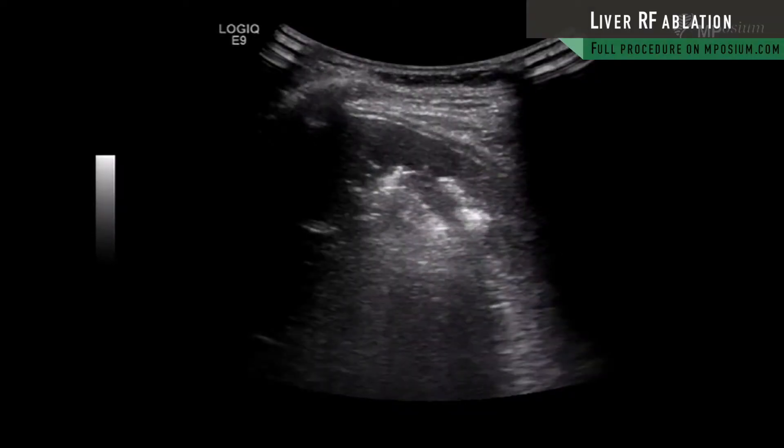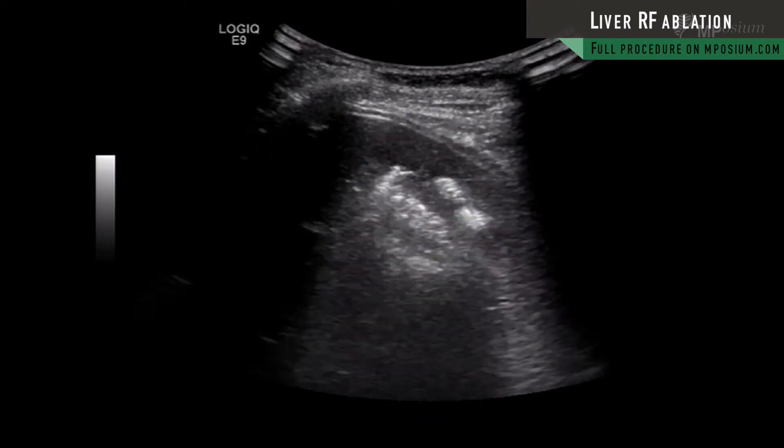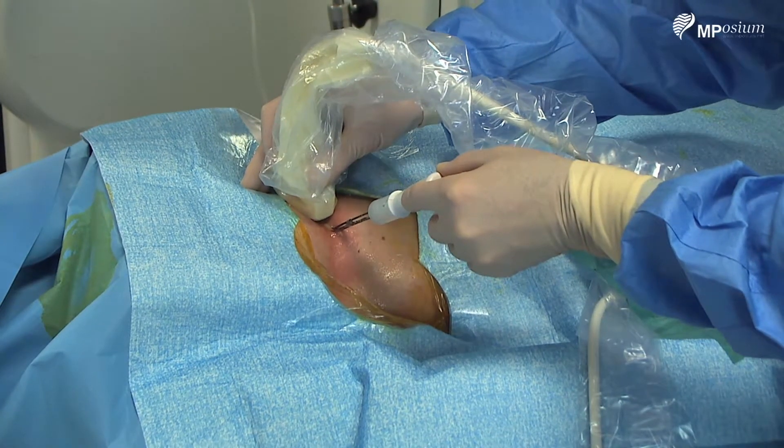I'm gently withdrawing my needle, as you can see. You can see the tip of my cluster is now exceeding the ablation zone.